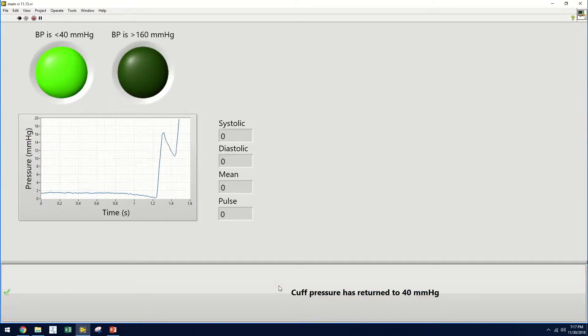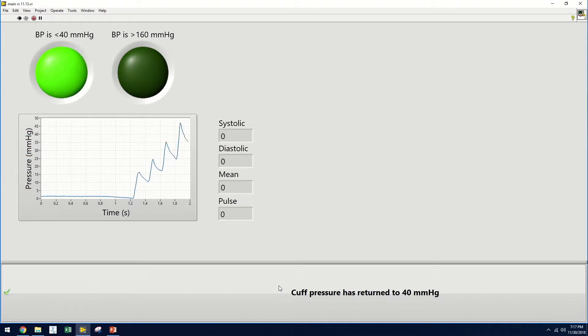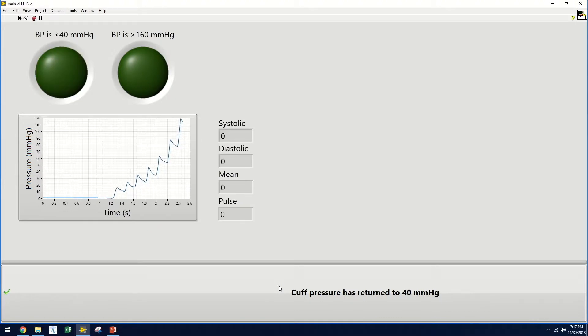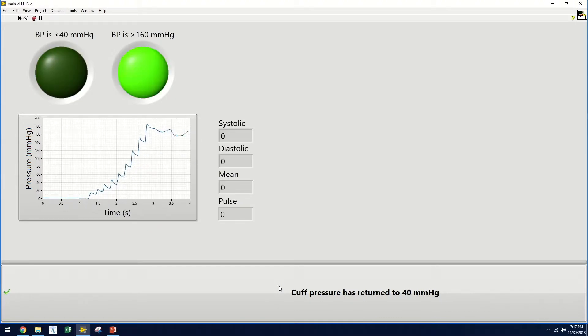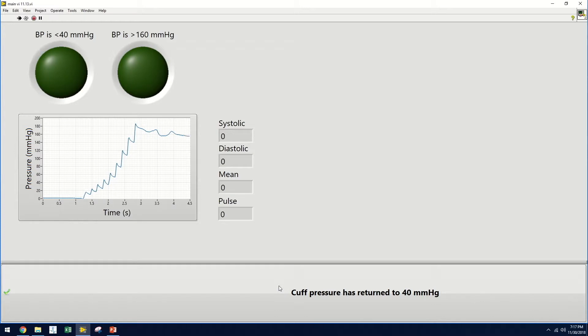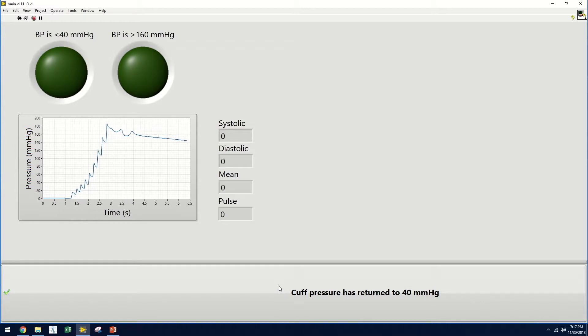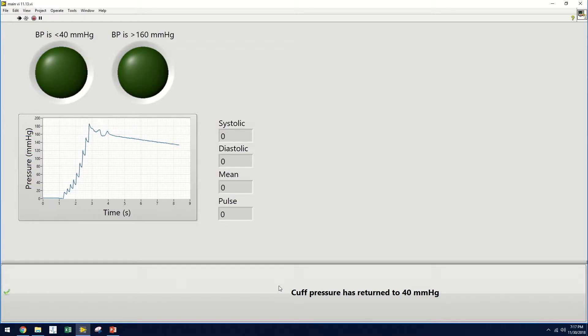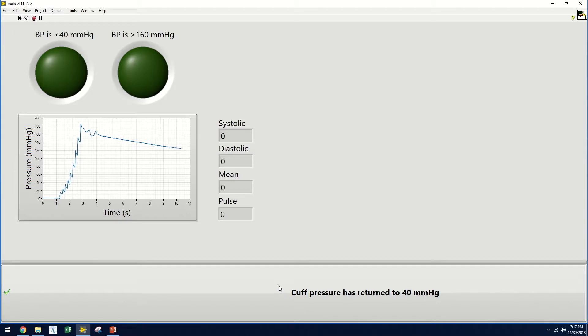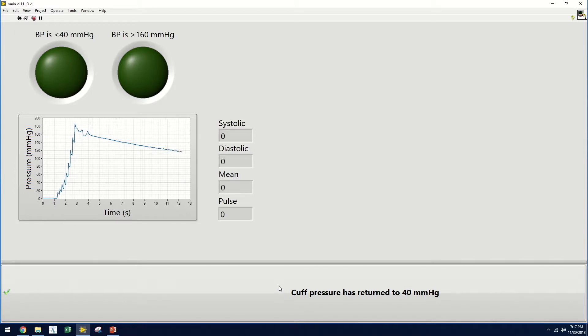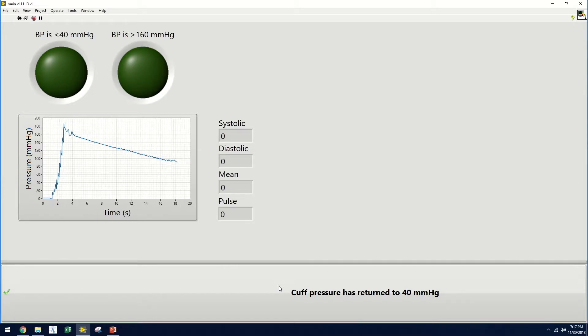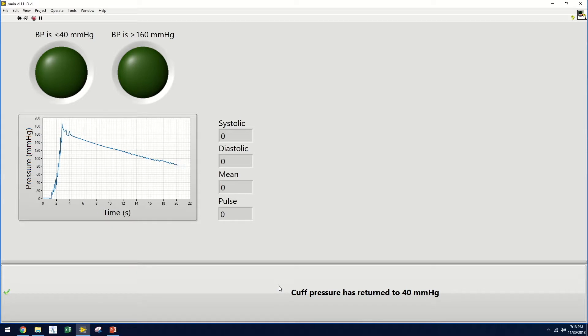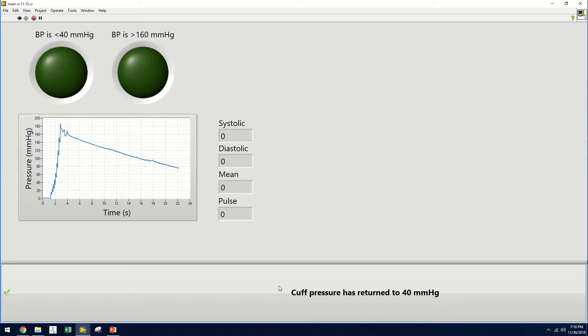Now the user can begin inflating the patient's blood pressure cuff. An LED will indicate when the pressure in the cuff has exceeded 160 mmHg, and the user may stop inflating it. Once this occurs, a second LED will eventually indicate when the pressure has returned to 40 mmHg. The user will then click the button at the bottom of the screen to indicate that the pressure has returned to this level, and the blood pressure information will then appear to the user.